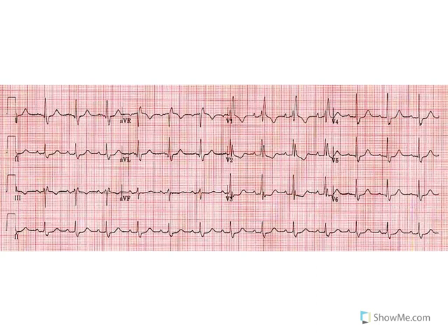Some people say you should see the RSR prime pattern. You do see RSR prime in those leads, and that's fine. But again, don't just look for bunny ears.